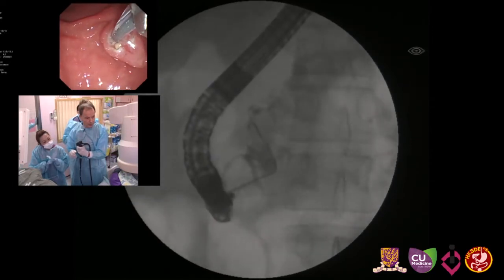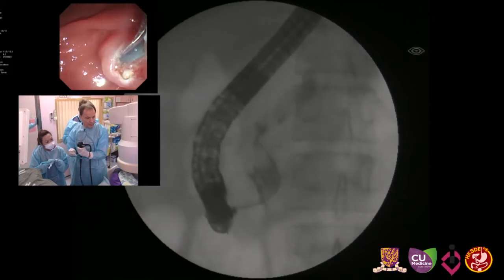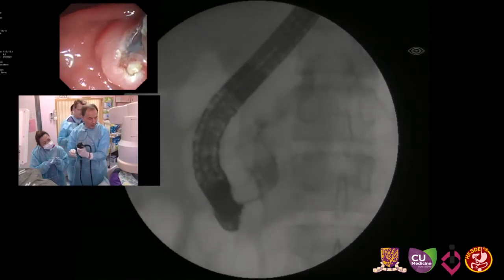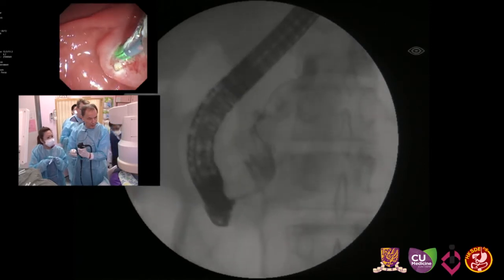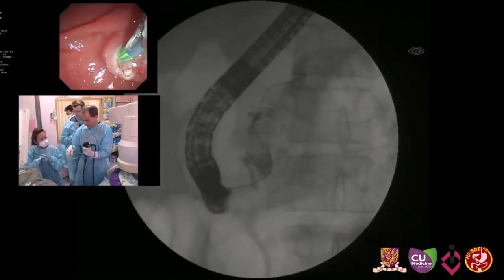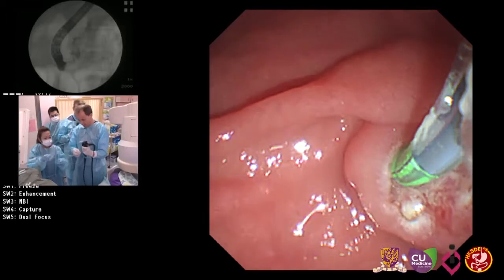What will you do for such a big stone? Usually we would proceed to extracorporeal shockwave lithotripsy. But because the stones are so close to the pancreatic orifice, we can try to use SpyGlass. There we go. Okay, so that means we will now lock the wire. That means Natalie will split the wire and prepare a 6 millimeter Hurricane balloon.